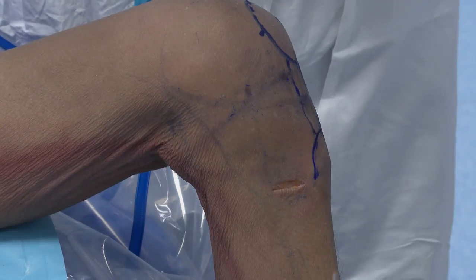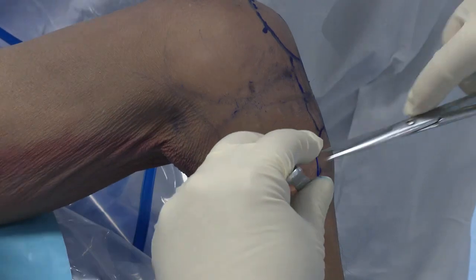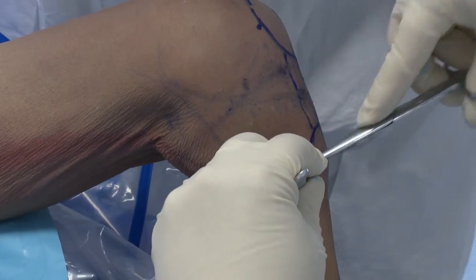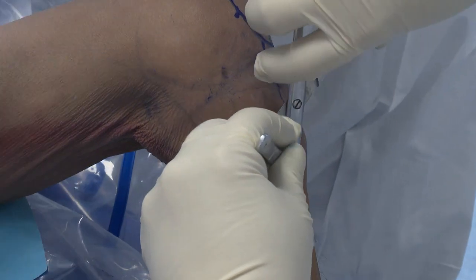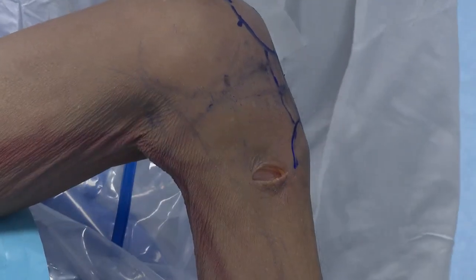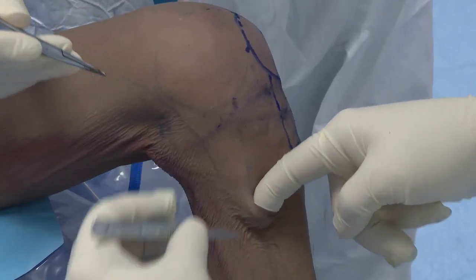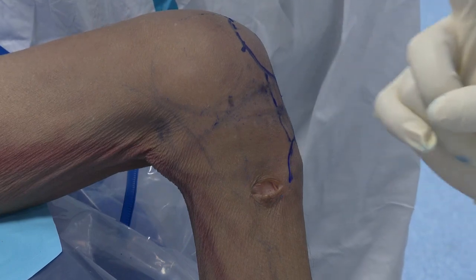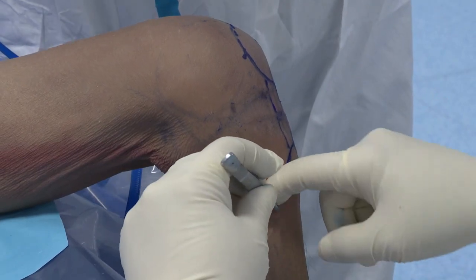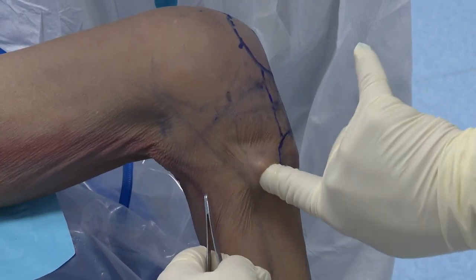Okay, so like this way, okay, and then you use these scissors. Okay, good. And then your hand lower, please. Lower, please. Oh my God, a lot of restrictions. So then put your finger in the skin. This is safe. Finger. 就用手指. Really safe because you just open the skin and then put your finger. You will not injure the nerve.